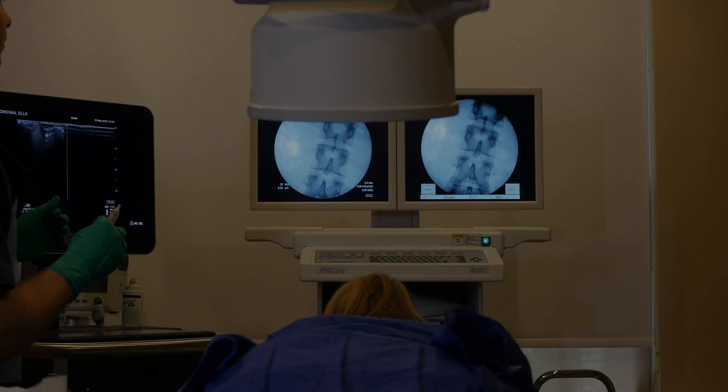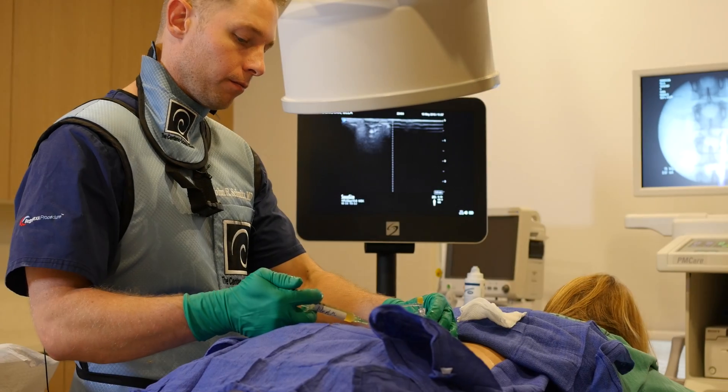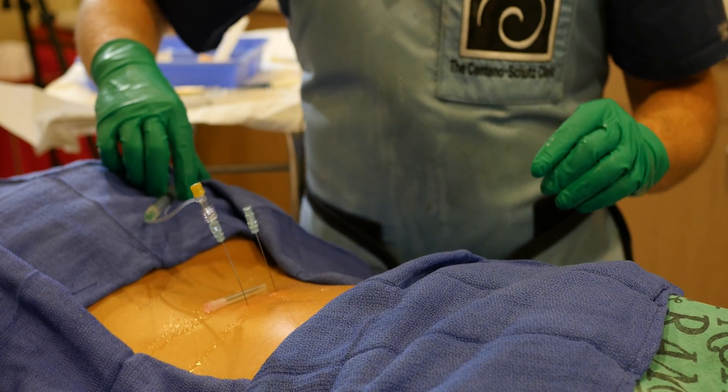To really understand why Regenexx is very different, let's take a look at one of our procedures. What you're about to see your orthopedic surgeon can't do, the guy down the street that does a little bit of ultrasound can't do — so let's take a look at this advanced precise guided work.